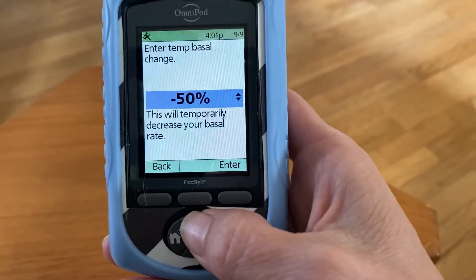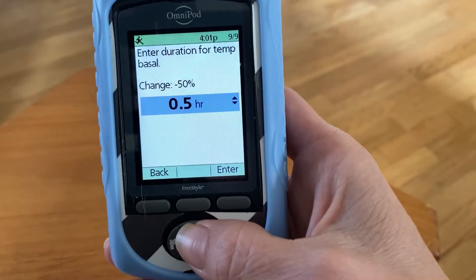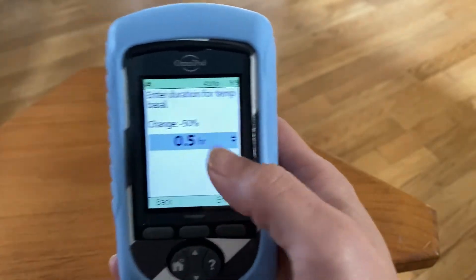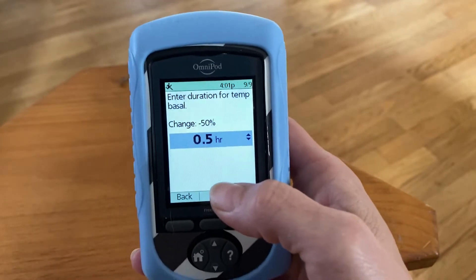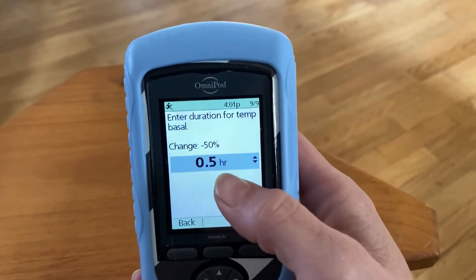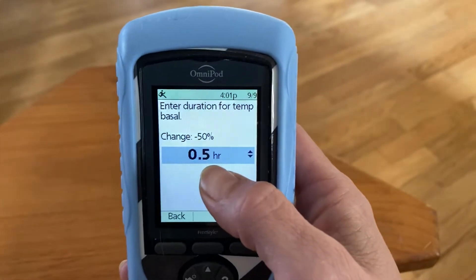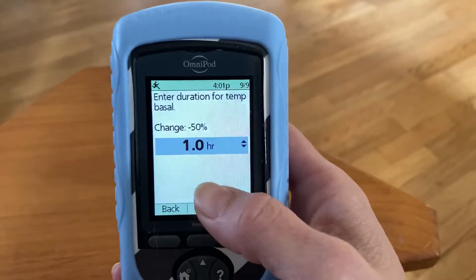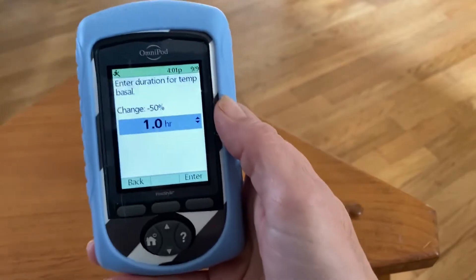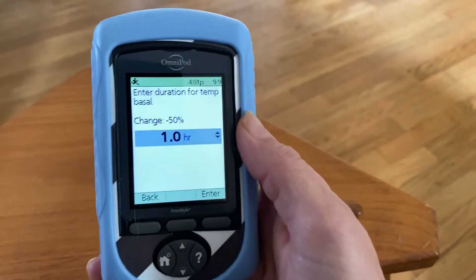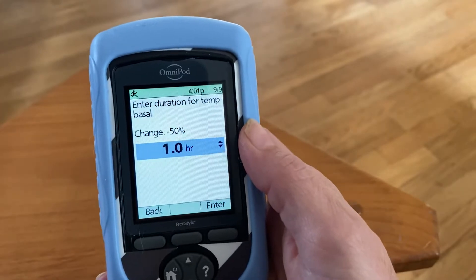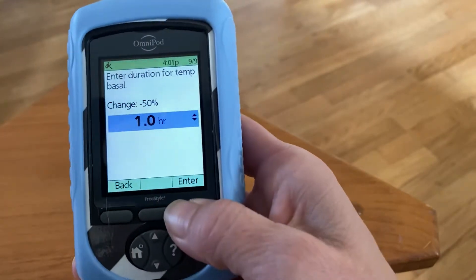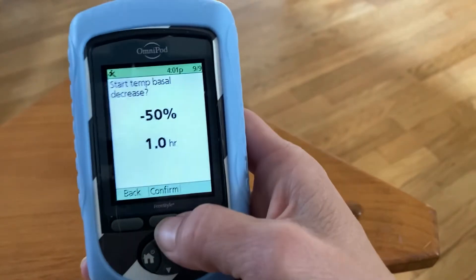If I chose minus 50 percent, I would press enter, and then it wants to know for how long — because you obviously don't want to do that indefinitely. It starts out with a half-hour option, or you can do an hour. I normally select something like an hour or an hour and a half, but I wouldn't let her go that long without checking her blood sugar.